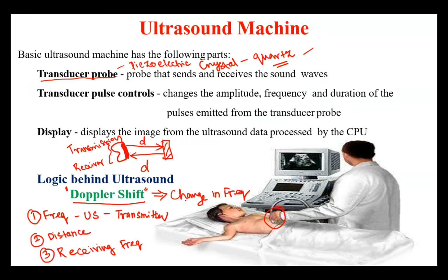Change in frequency means, I transmit some frequency here and I receive some frequency here, right? So will the frequency I transmit and the frequency I receive be the same? For example, I am going to pass 3 megahertz here. Now will the received frequency be 3 megahertz or different? You will receive a different frequency, right? Am I clear? Yes, sir.